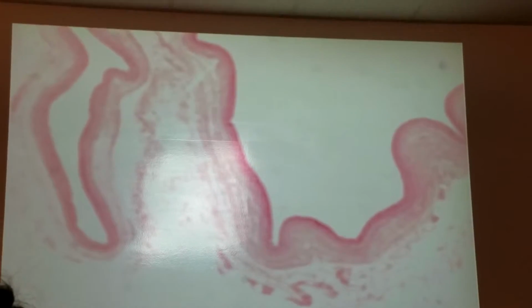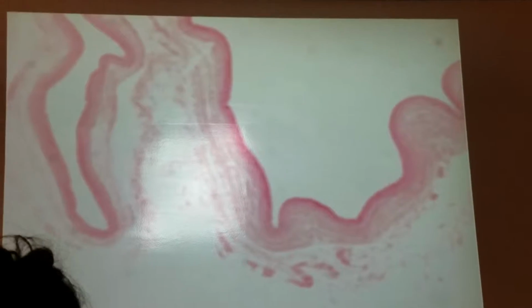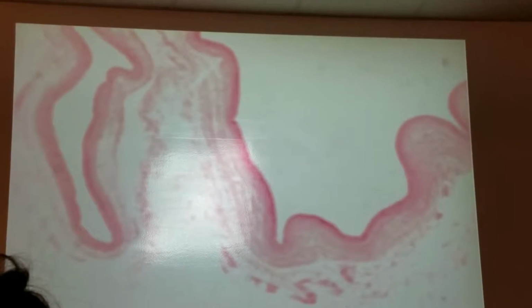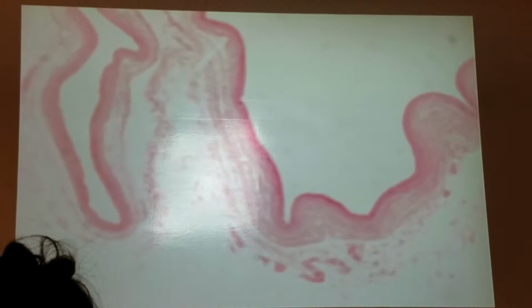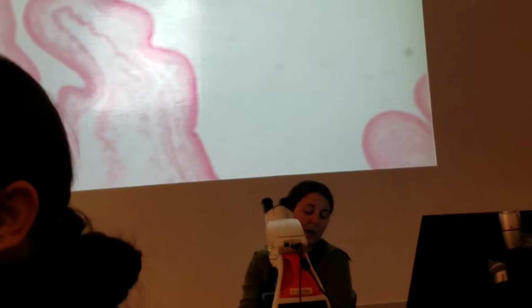The statement says you will only be asked the artery vein structures from the artery vein slide. So even though we may come across another slide that has arteries and veins in it, you will not be asked about the layers. The structures that we have to know are just the layers. We went over this in class, all of our little tunicas: tunica intima, tunica media, and the tunica externa. Those are our three layers.